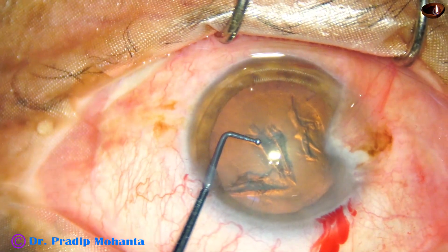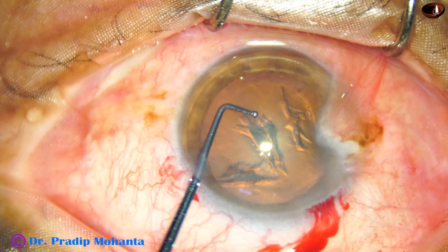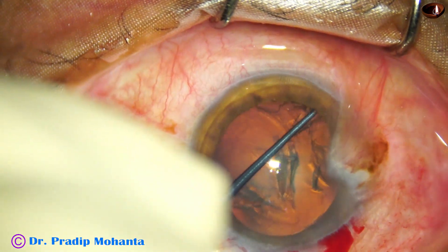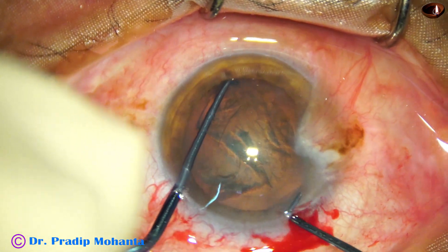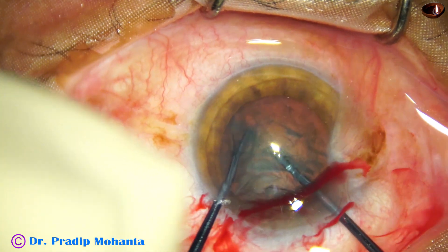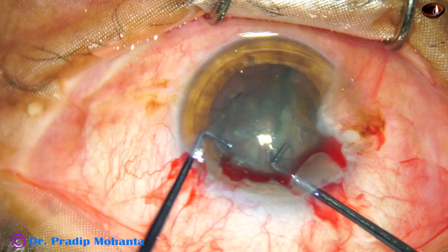This is the long nucleus sustainer — it has a 1.9 millimeter tip length. It hooks the equator like this, rotating the nucleus a few clock hours. And now here goes the pre-chopper; the two instruments meet and we do lateral separation.